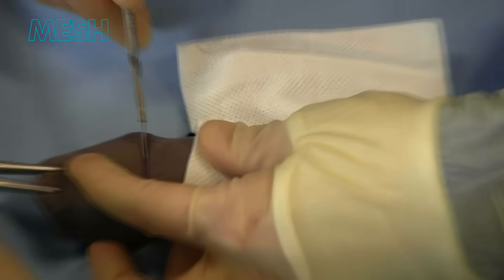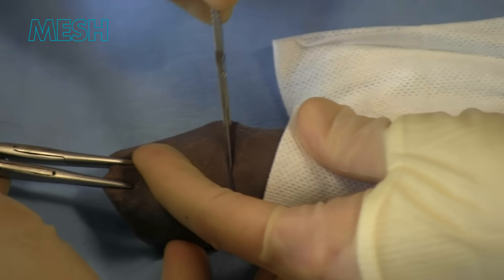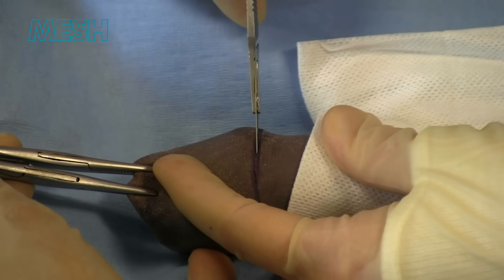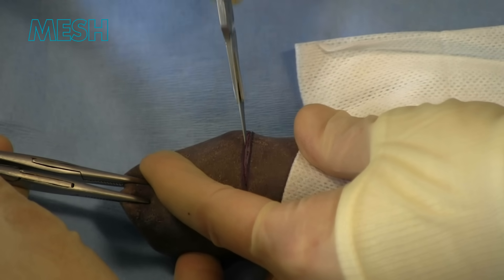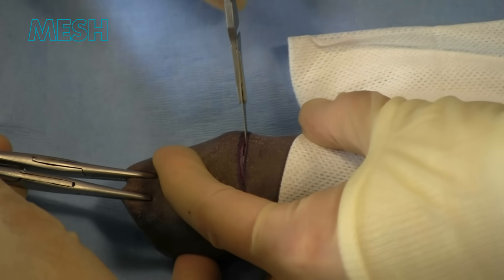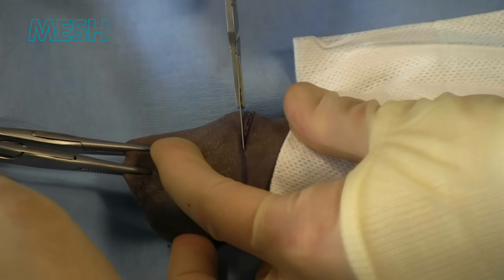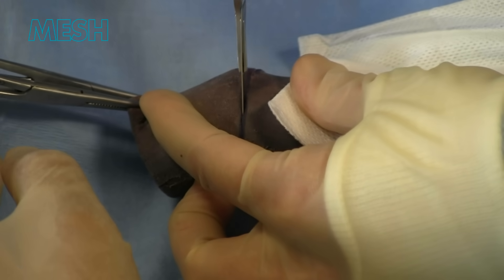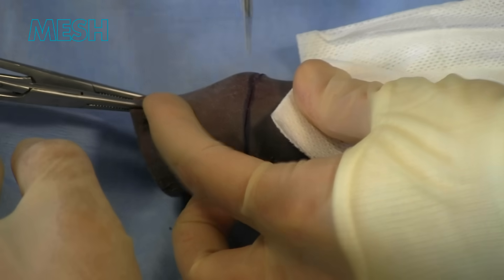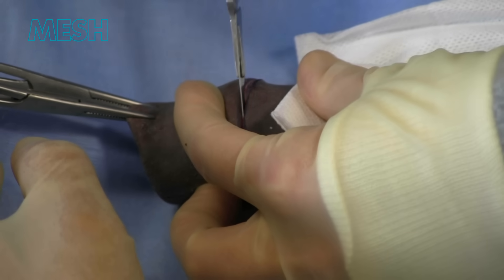With each incision we try and produce some counter traction with the swab and the clips to allow the plane to open up into Buck's fascia. You can see the small fibres peeling away and it's important to concentrate on these areas. Bipolar diathermy at this stage can be used to deal with vessels as you are proceeding.